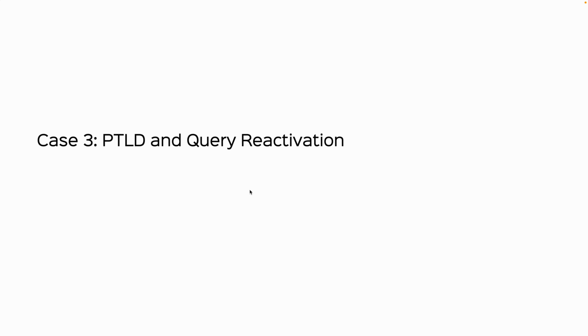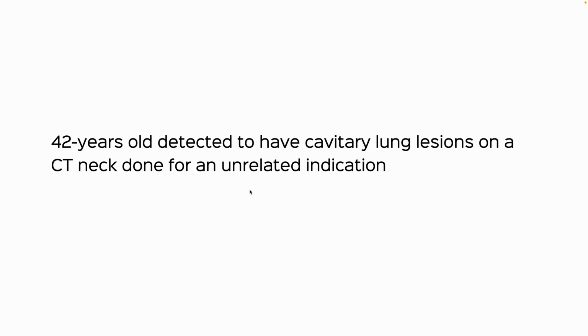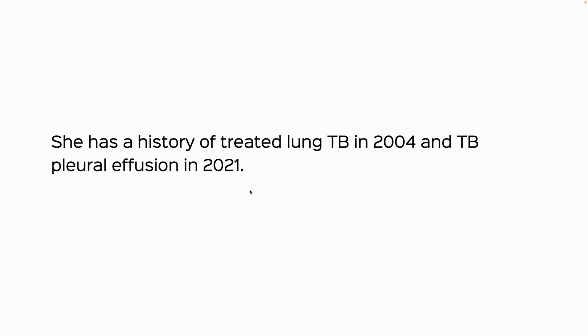Today is the third case and it's titled PTLD and Query Reactivation. So I reported this case today. A 42-year-old detected to have cavitary lung lesions on a CT neck done for an unrelated indication. This was about 3 weeks ago. And she had a history of treated lung TB in 2004 and TB pleural effusion in 2021.